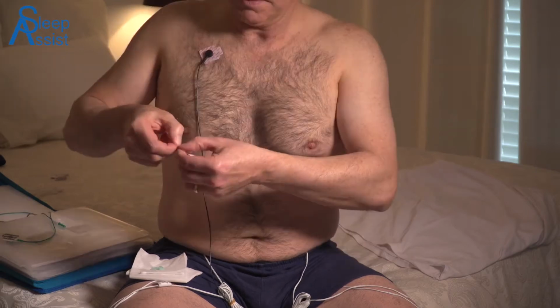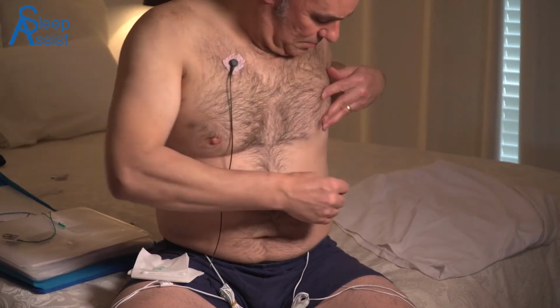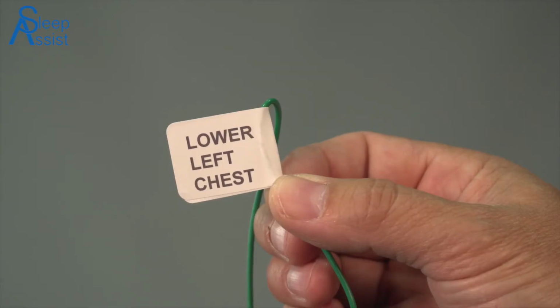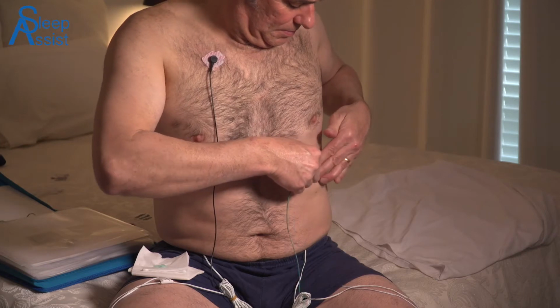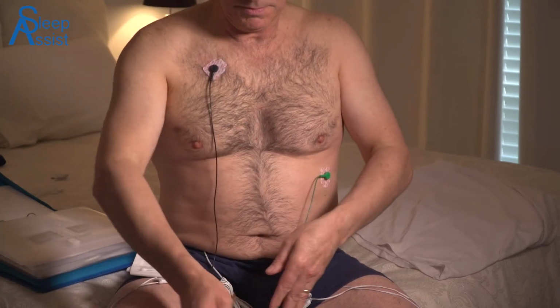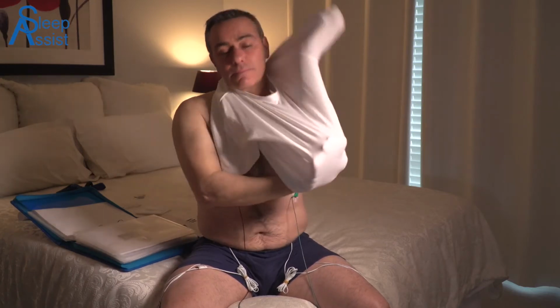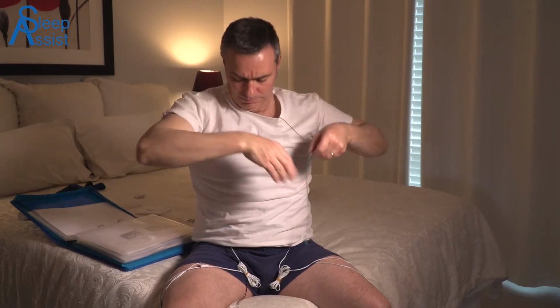Repeat this procedure on the left lower chest area using a fresh cotton bud and a fresh alcohol swab, and apply the adhesive electrode labelled left lower chest. Place your night garment on now over the ECG adhesive electrodes and leads. Ensure the leads are protruding through the top of your garment, ready to be connected at a later stage.